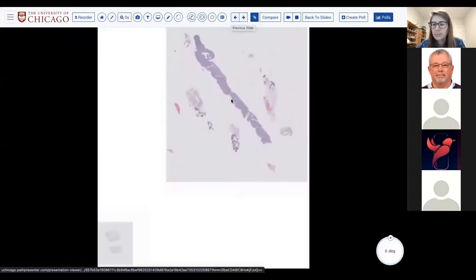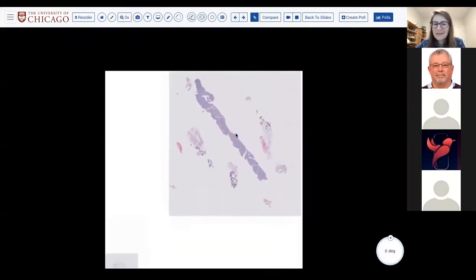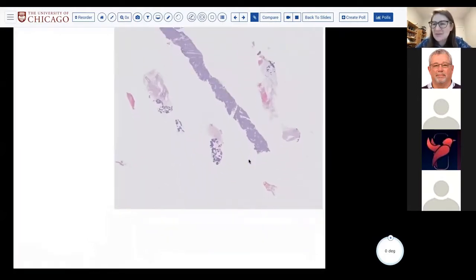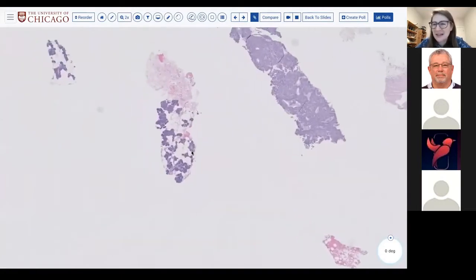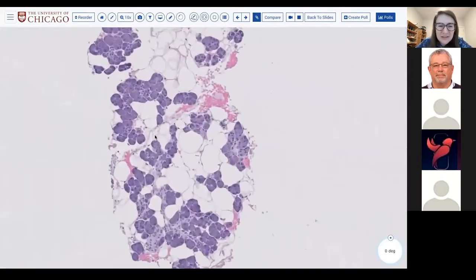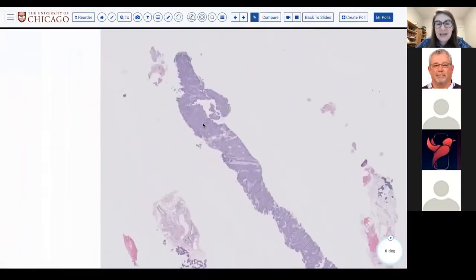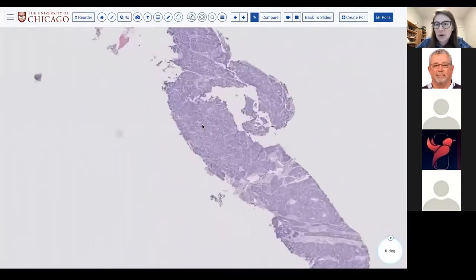Awesome, well done. All right, so the next is one of my favorites, because I don't think we see it very often, although I think we've seen a few in the past year that have been really exciting because we've got to reiterate this diagnosis. But looking in the surroundings, we have some serous parotid tissue as well. And we have, again, a very, very cellular core.